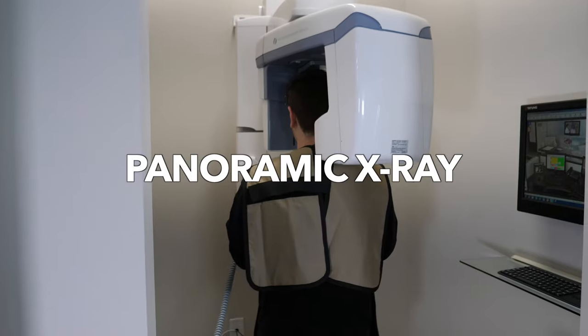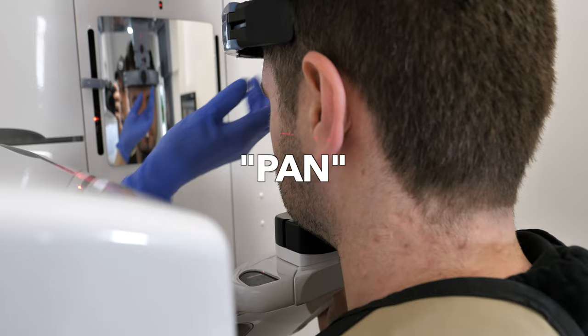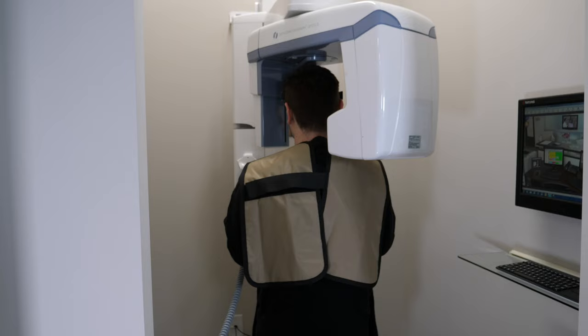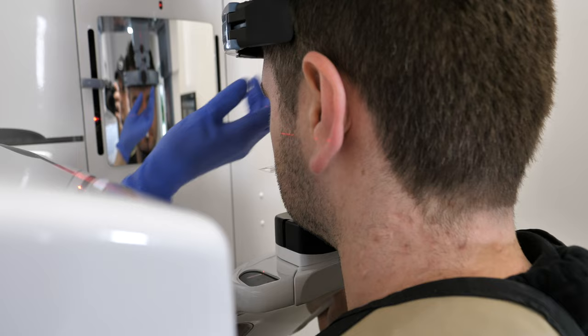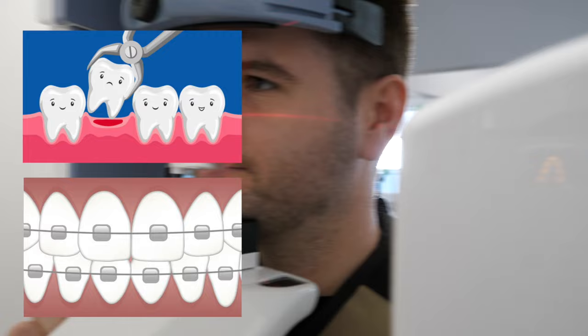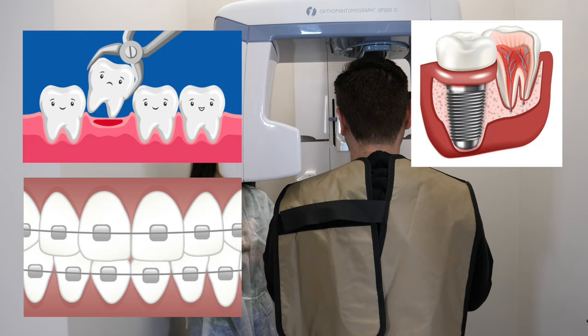A panoramic x-ray, or pan, or pano, is a full mouth image that captures your entire mouth, including your teeth, jaw, TMJ, and areas around your wisdom teeth. Panoramic x-rays are usually taken prior to orthodontics if you're getting braces, or extractions if you need to get a tooth pulled, and other various reasons such as to evaluate for implants and or check for any pathologies in your mouth.